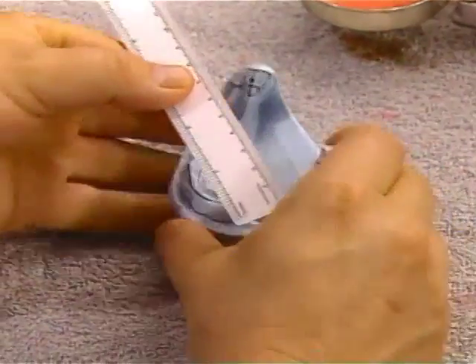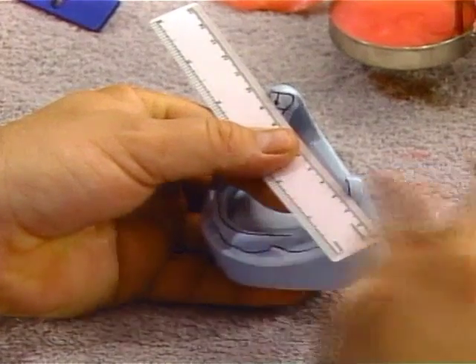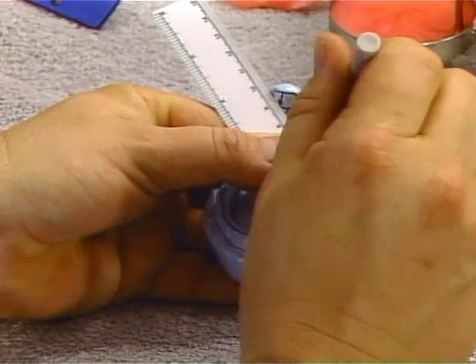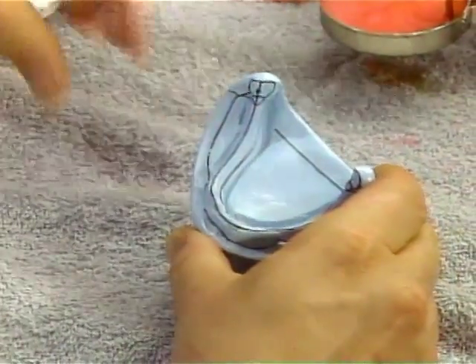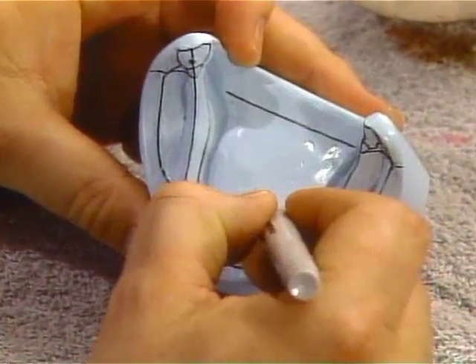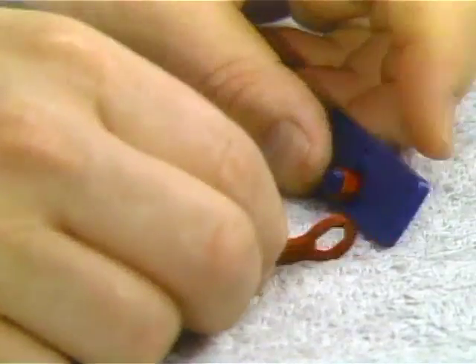Lay a ruler between the dots on the retromolar pad. With a pencil, mark a line on the floor of the lower cast between the two dots. Mark an X on the center line of the floor of the cast, halfway between the line you just drew and the anterior crest of the ridge. Remove the pin assembly from the blue bar.